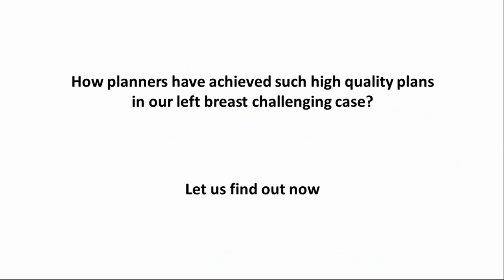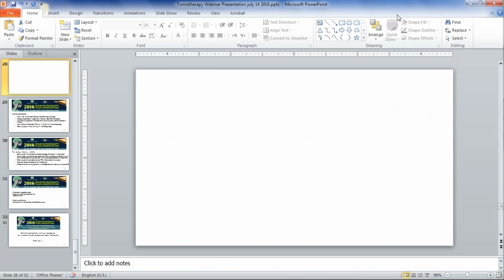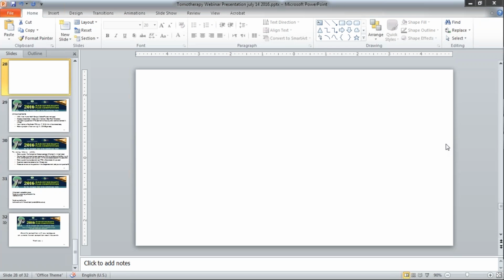So let's find out with Dimitro, and he will share with us his plan, because he used a tomotherapy plan. And to tell you something, Dimitro scored in the actual plan competition close to 84.7, I think, in his plan.